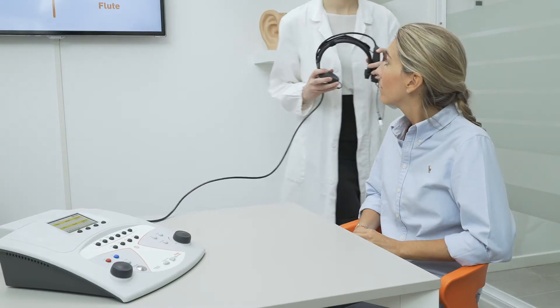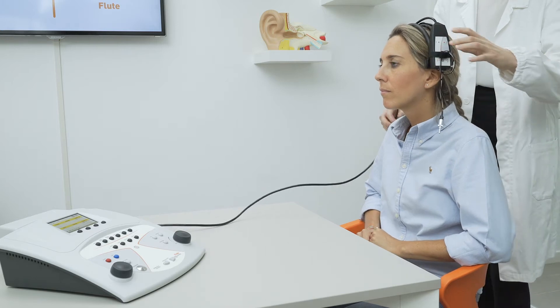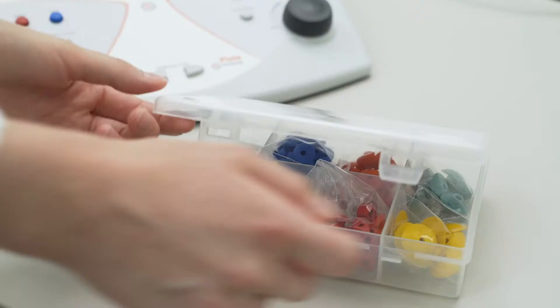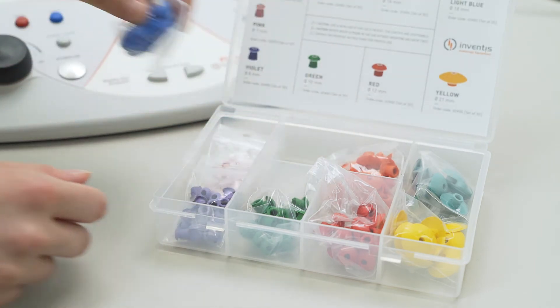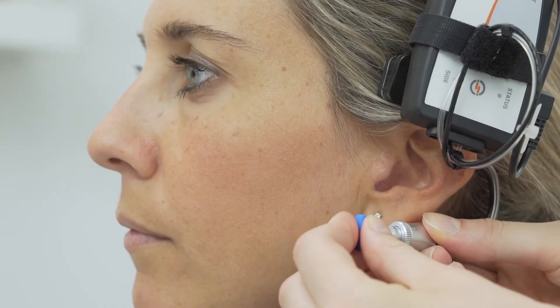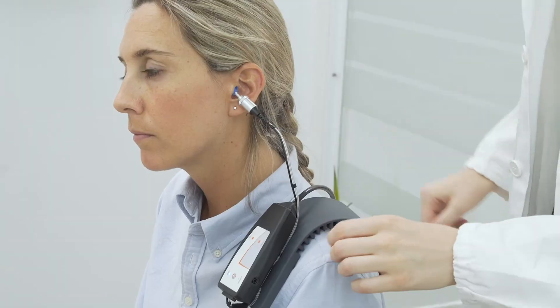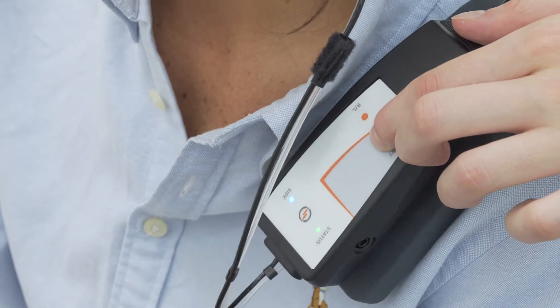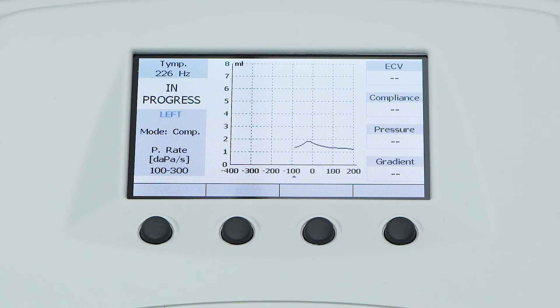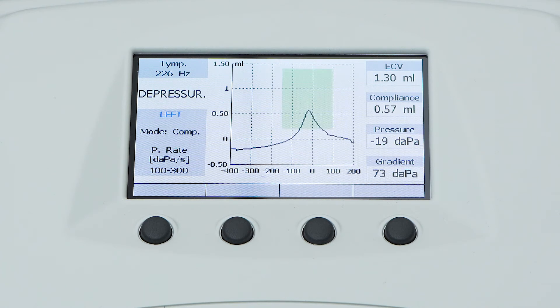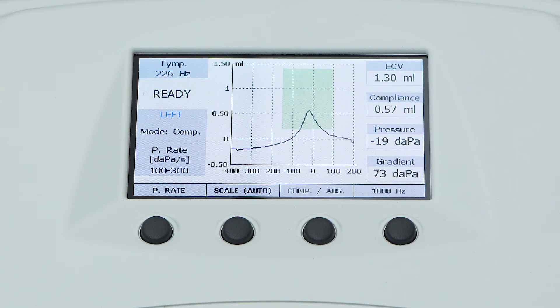After having set all the parameters, it is possible to start the examination. Select the ear tip that best suits the patient and introduce the probe into the patient's ear canal. Start the exam by simply pressing the start button on the keyboard or on the control box. The results of the examination will be shown on the right of the screen, including the ear canal volume, the compliance and pressure value at the tympanogram's peak, and the gradient.